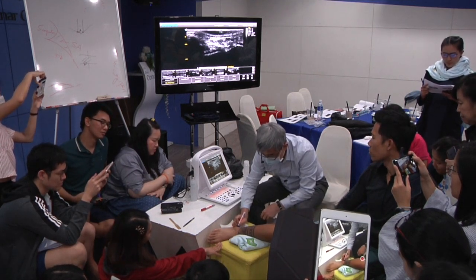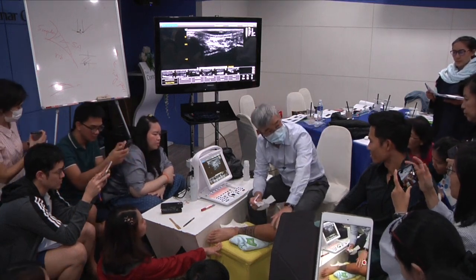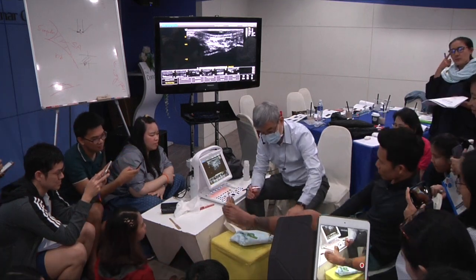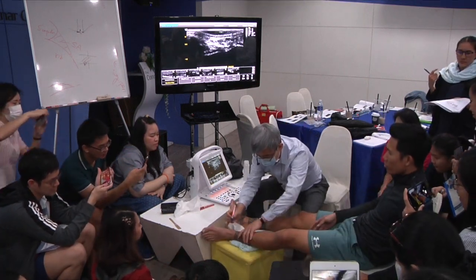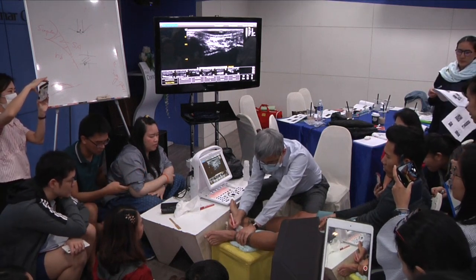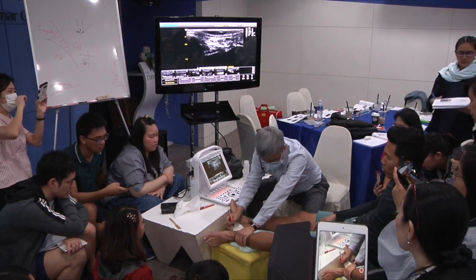Good. So basically, I think you need to stay here and do not move. Right. Tibialis posterior, right? Achilles tendon, right?